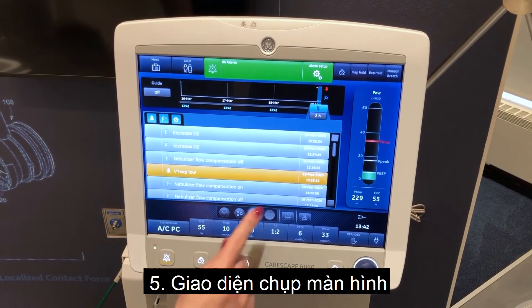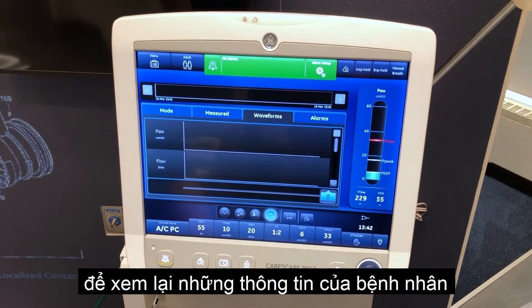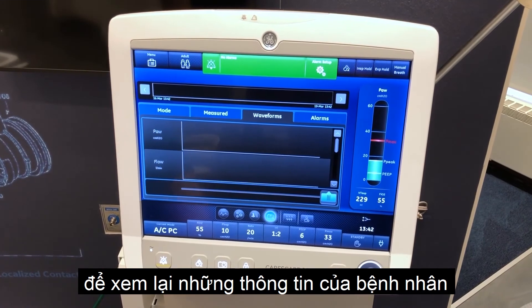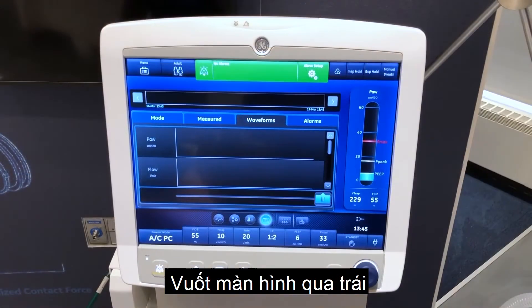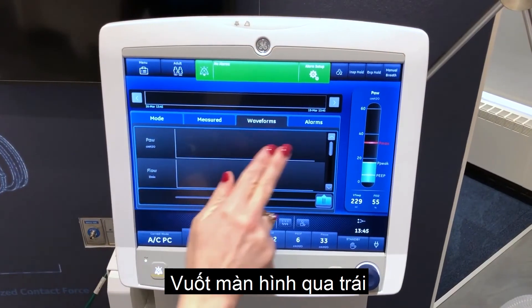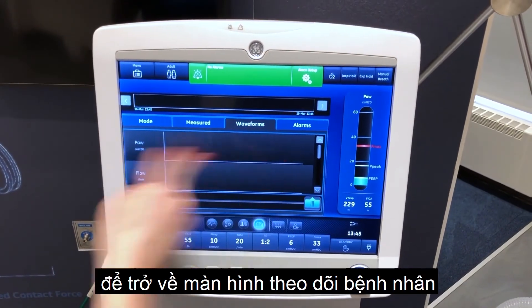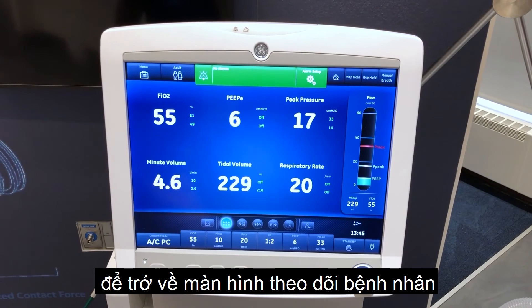Snapshot trends view to view saved patient data. Swipe to the left to return to the patient status workspace.